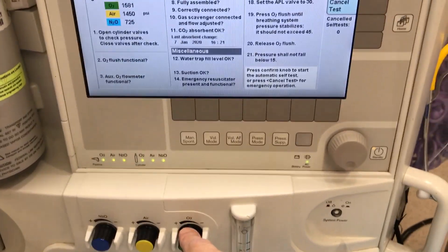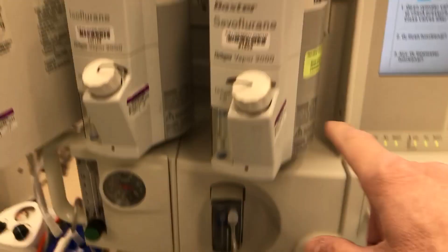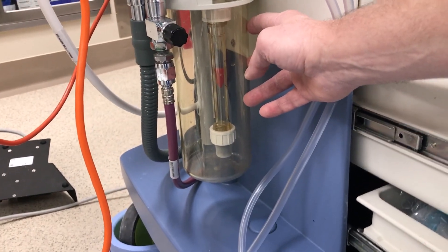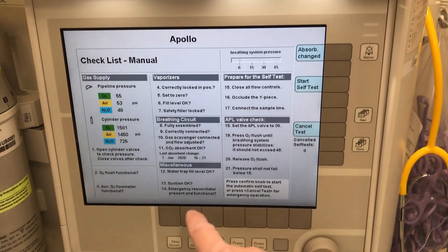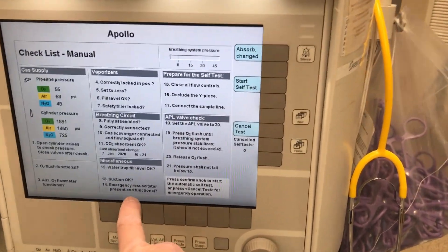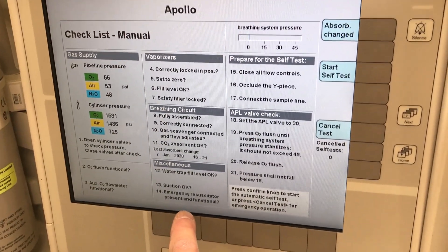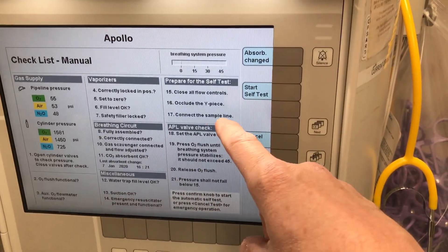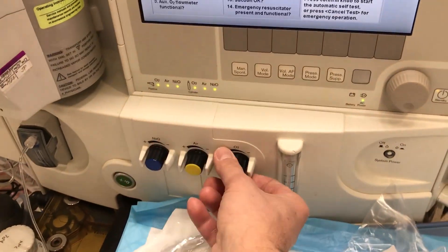There is a water trap — vapor water accumulates in a trap that needs to be emptied if it fills up, but most of the time it remains dry, so that shouldn't be a concern. Make sure suction is okay and there is an Ambu bag in the back. These machines are not designed for long-term ventilation but have the sturdiness to do so. It's always good to have an Ambu bag in the room.